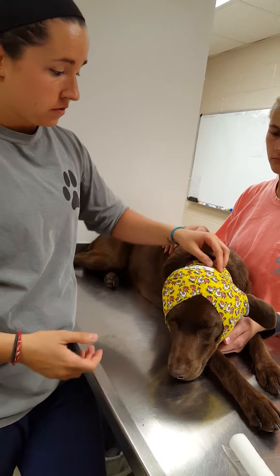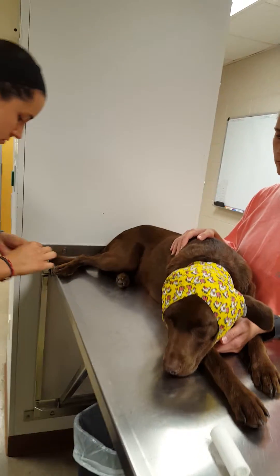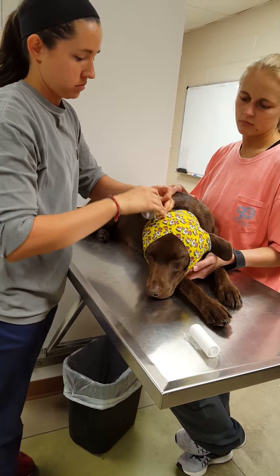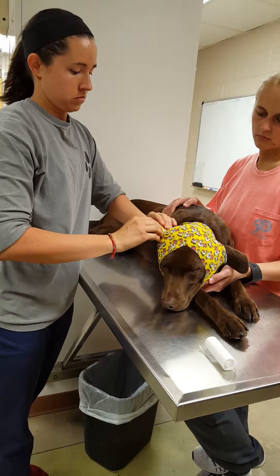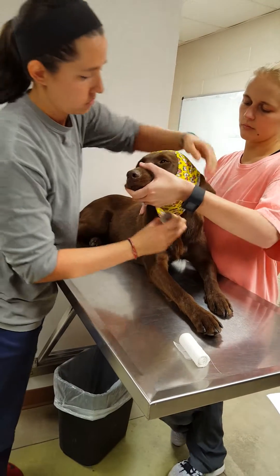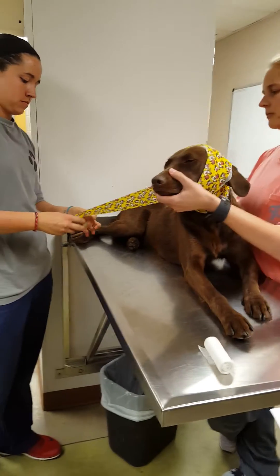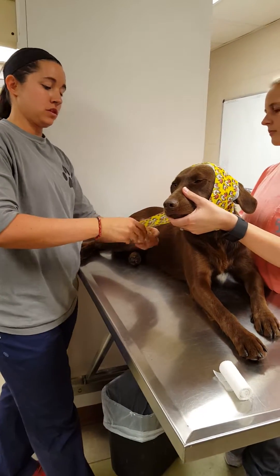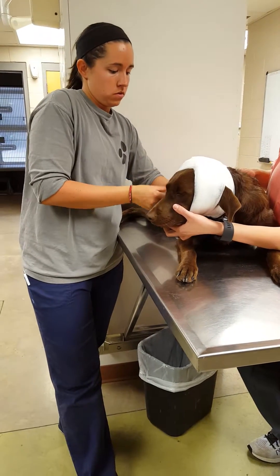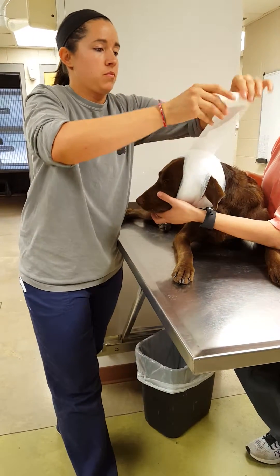So now I'll take the bandage off, just do everything I did backwards. I've got the vet wrap off, now I'll just unroll the gauze wrap the same way.